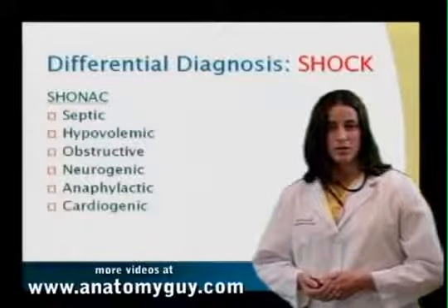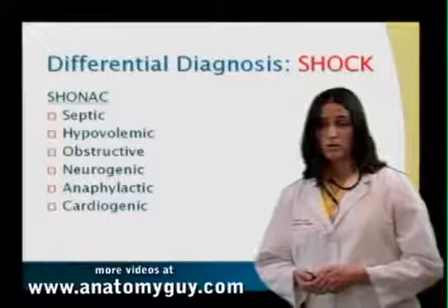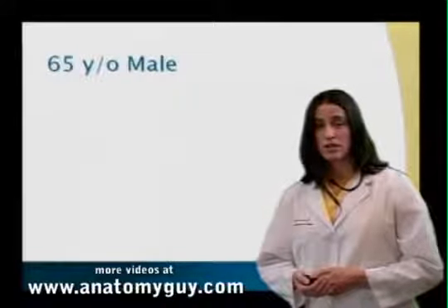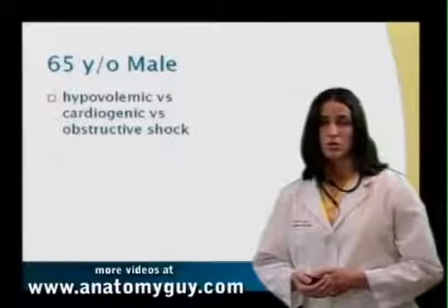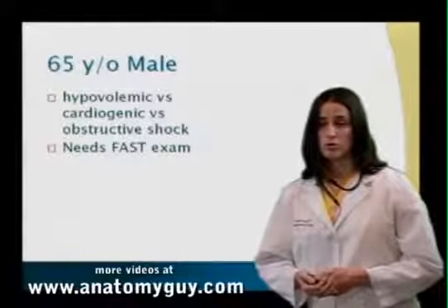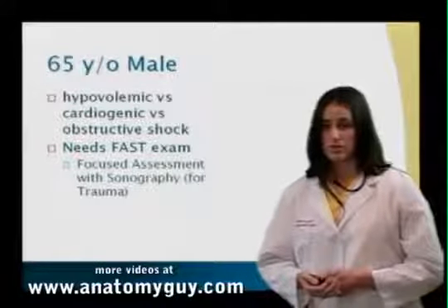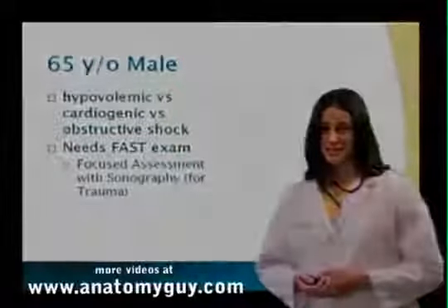Could this be cardiogenic shock? Possibly. He could be having a heart attack. His blood pressure is down. He has had diaphoresis. So to help us to differentiate between these types of shocks, we've narrowed this down to hypovolemic, cardiogenic, or obstructive. We can use a bedside modality for ultrasound, a FAST exam, or a focused assessment with sonography for trauma, but there are medical applications, as we will see here. And with that, Dr. Byers will lead us through a FAST exam.